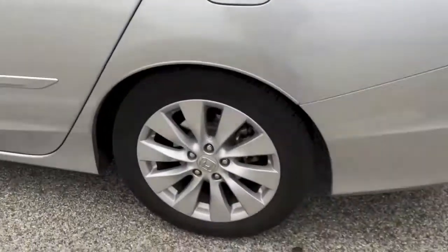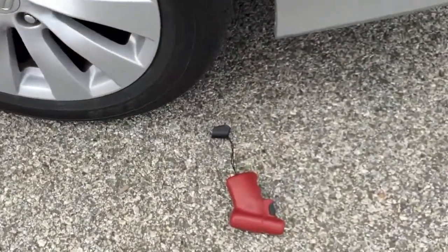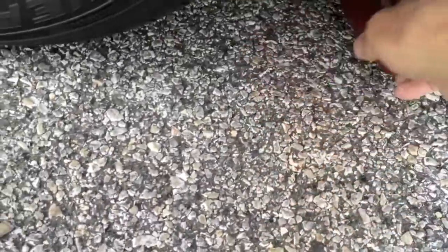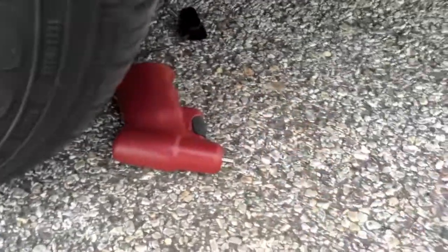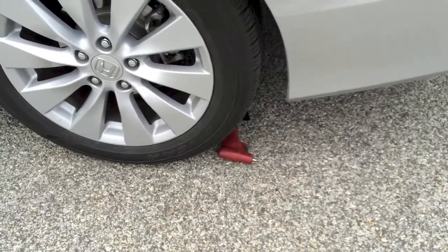We're going to see if the Easy Aero driver will survive running over it with the car. I'm going to place this into the wheel, and then I'm going to ask Diana to back over it. Go ahead and back over it, Diana.